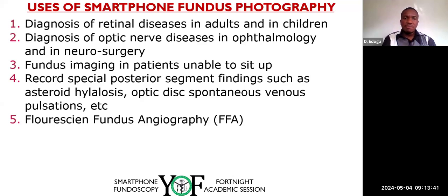I found out that if a patient sees the image of the retina and you explain some of the findings, they are more likely to take up care. So either you show it on the screen of the phone, or you can connect the phone to an external display where you can use a larger display to explain to the patient or maybe the patient's relative. And then it can also be transmitted for teleophthalmology. So these are the uses of smartphone photography.